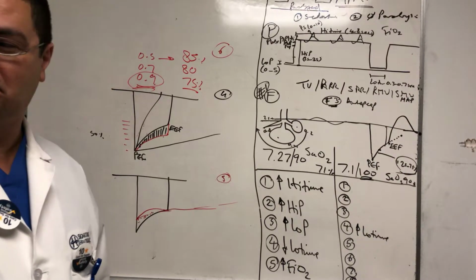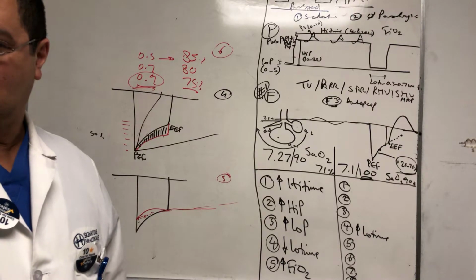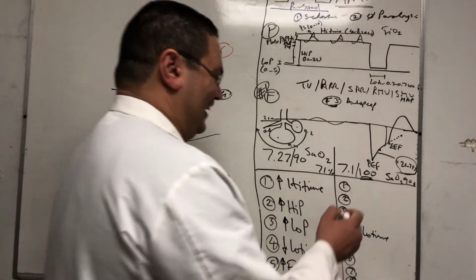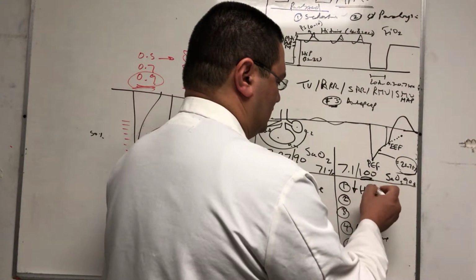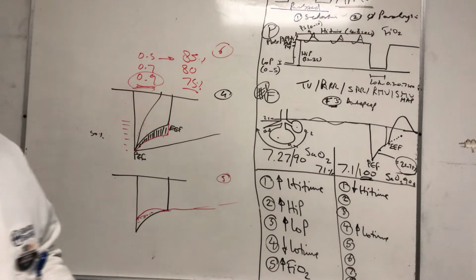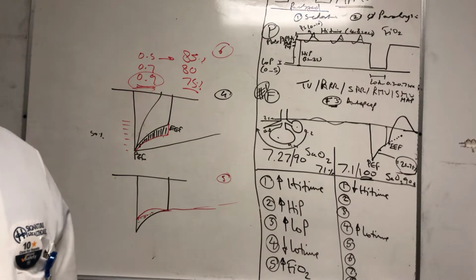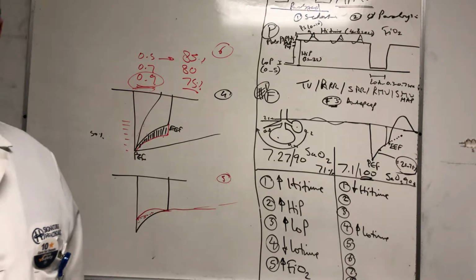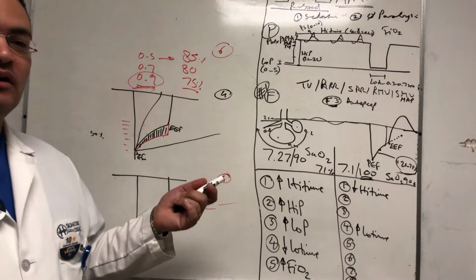What else? Oh my God! Decrease the high time. Huh? What? Decrease the high time. That's the most preferred. See? Have you ever seen a radiologist that can answer this stuff? When you're sitting there reading an X-ray and then calling the ICU resident and saying, "Hey, I think you should increase your high time because the thing is inflated too much." All right. Anyway, so decrease the high time.